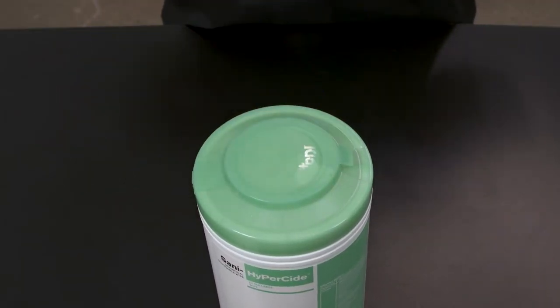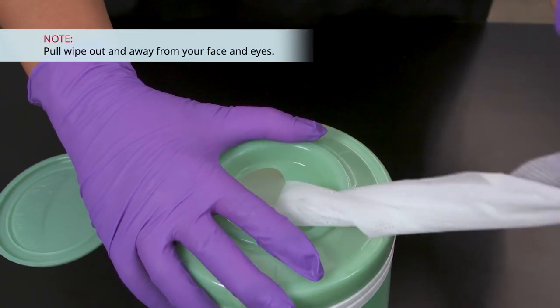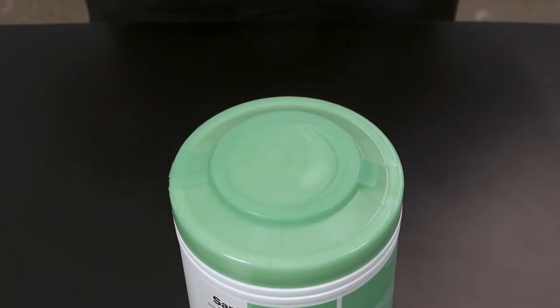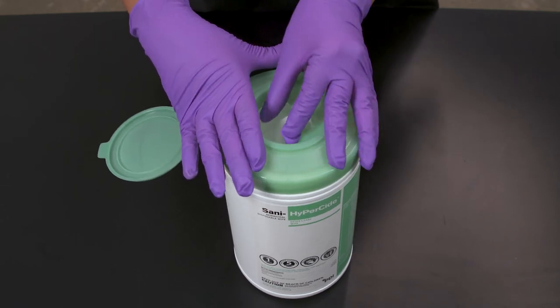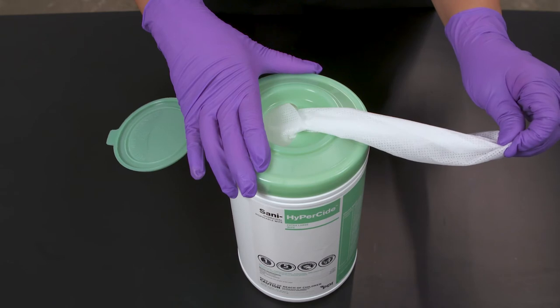Close the lid so it's snapped shut to prevent moisture loss. To dispense a single wipe, cover the opening halfway with one hand and pull the wipe with a uniform pull out and away from your face and eyes. Close the lid so it snaps shut to prevent moisture loss. If the wipe falls back into the canister, the large opening allows for easy retrieval — reach into the large opening and grab the tail of the wipe and thread it into the small opening.